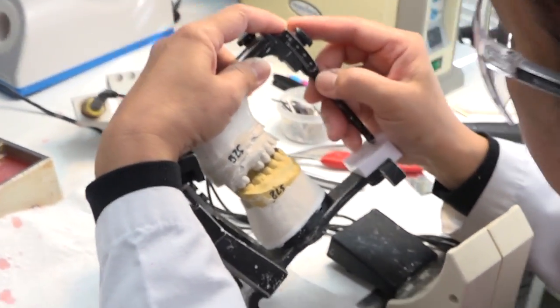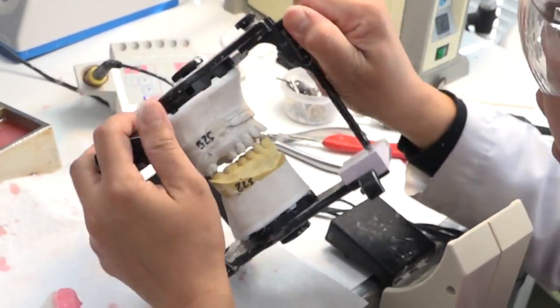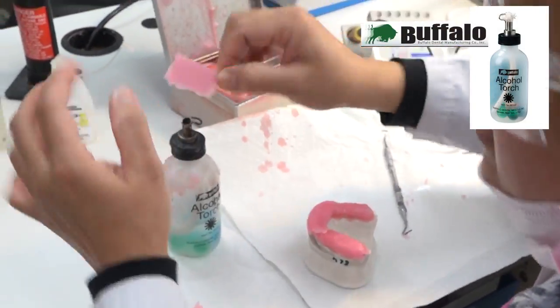Put model in articulator and increase bite to the right degree. Add soft pink number 3 wax to the model.